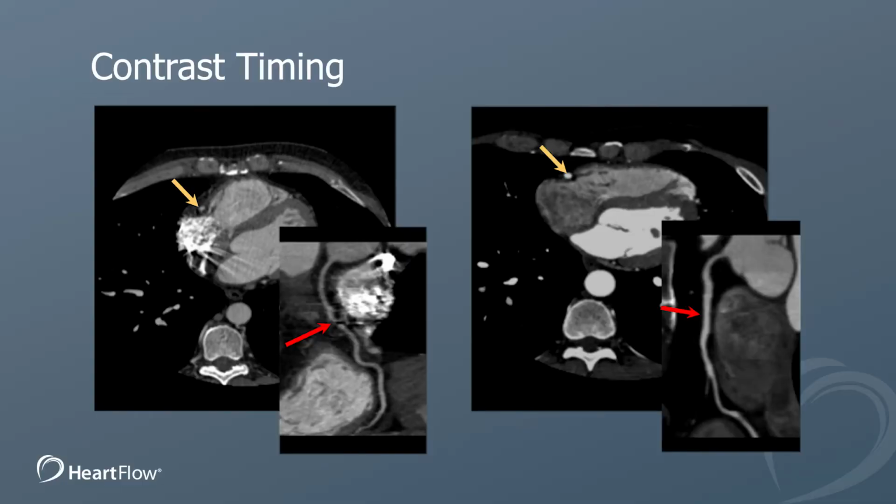So you need to know your scanner and how long your average coronary injection time will be. There are some patients that we actually use less contrast injection time, and the test bolus can be very helpful to letting us know when that's necessary. For example, a patient that has a very high cardiac output and rapidly transitions their contrast into the aorta and coronary arteries does not need contrast going after the scan is completed.